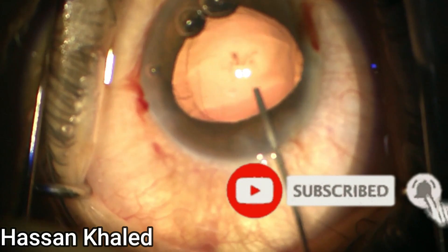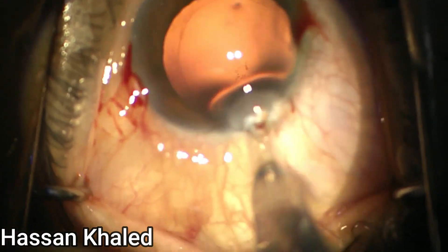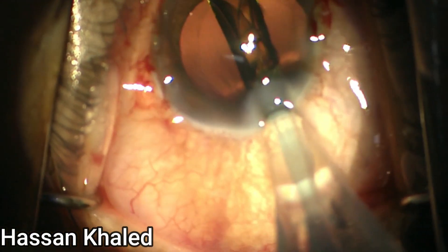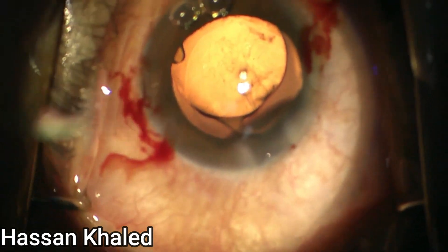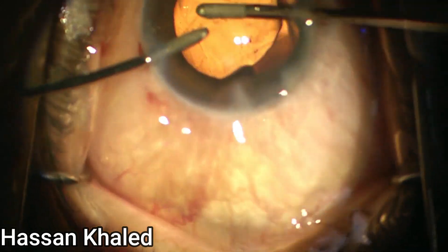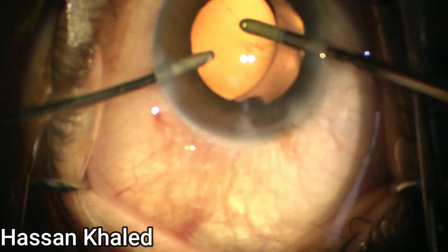Now injecting a cohesive OVD to form the capsular bag and implant a single-piece hydrophobic IOL inside the capsular bag. Then you can wash the OVD from the anterior chamber and also from behind the IOL.